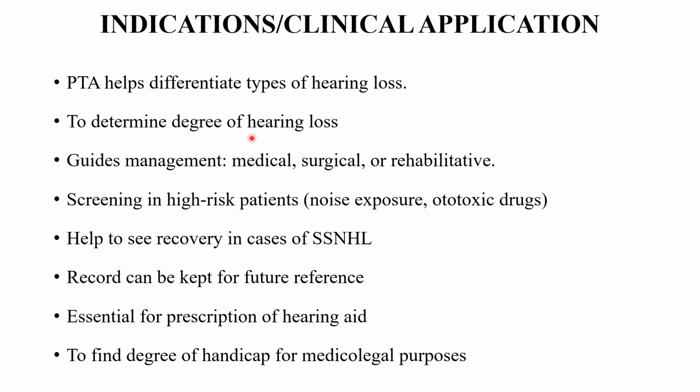It can be used as a guide to management for certain diseases, whether medical, surgical or rehabilitative. In surgical, if you are performing myringoplasty or tympanoplasty, ossiculoplasty, or myringotomy with grommets, the pure tone audiometry improvement will indicate the success of that procedure.